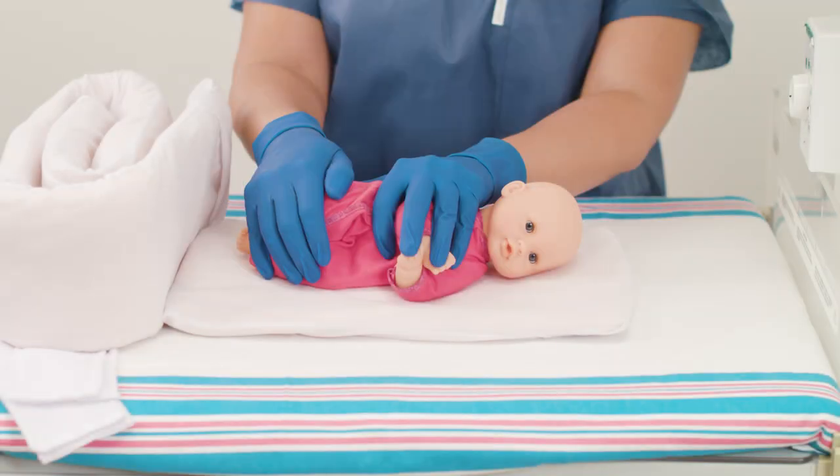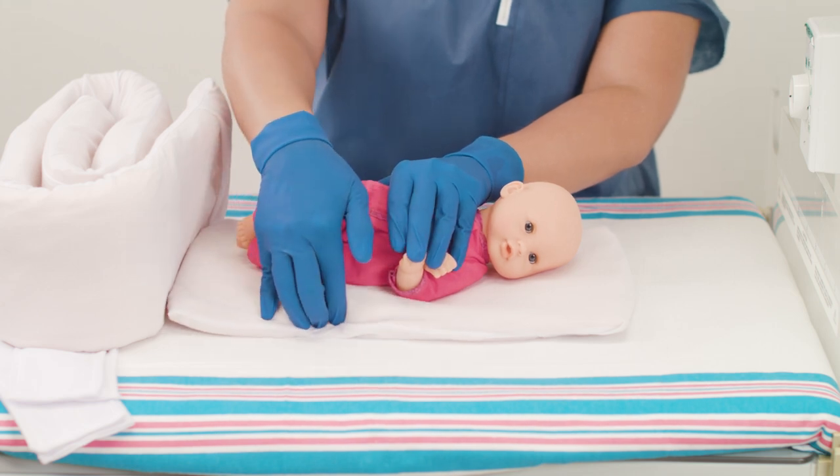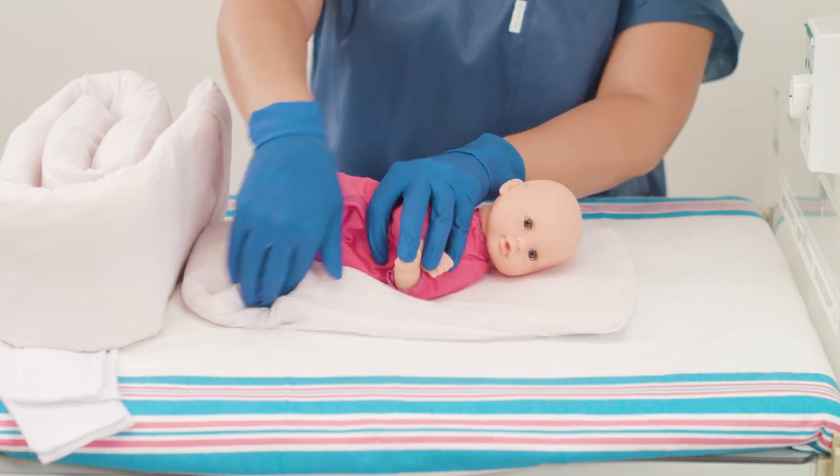For side lying, place the infant on the positioner with the head at the top. There should be slightly more positioner behind the baby than in the front. Mold the positioner along the back and the front of the infant.